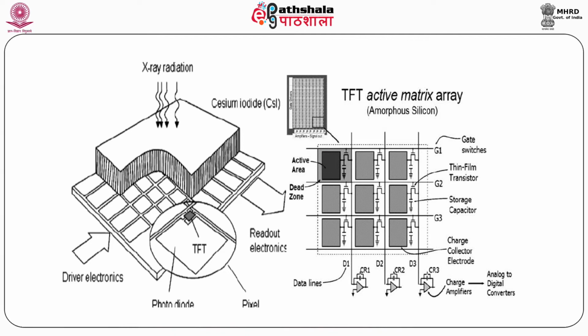Here the doses are comparatively less than conventional X-ray equipment. Digital images do not deteriorate physically or degrade. Images are distributed electronically throughout by web technology. But the disadvantage of DR is that spatial resolution is less as compared to film-screen radiography. Detectors are fragile, requiring careful handling, with a high initial cost, and since detectors in digital radiographic equipment are fixed, certain radiographic views cannot be obtained with this technology.